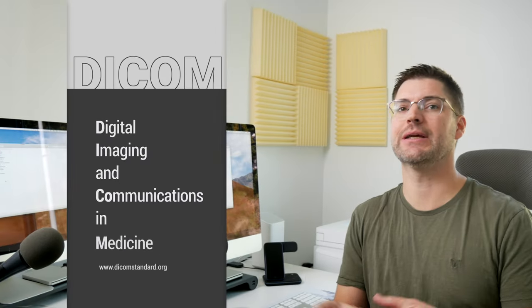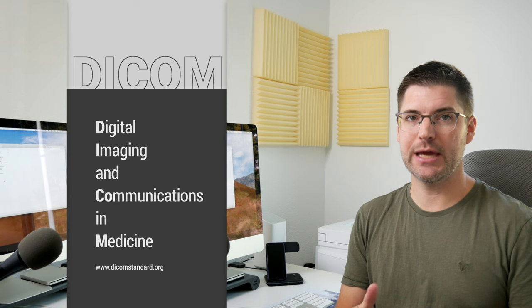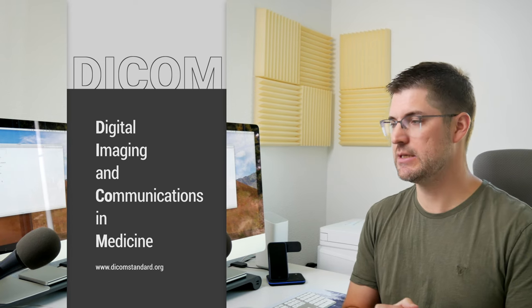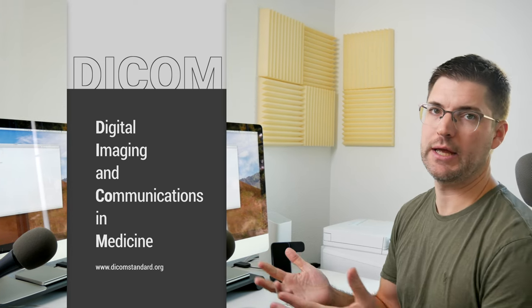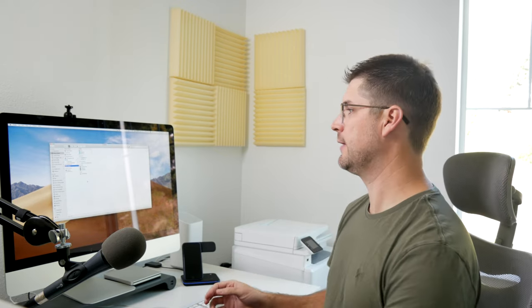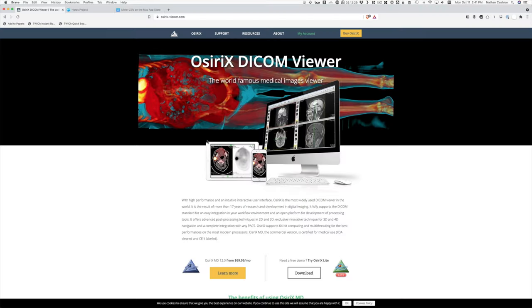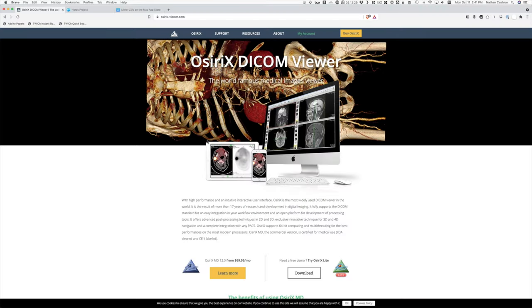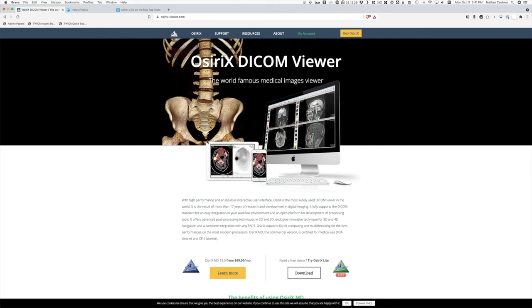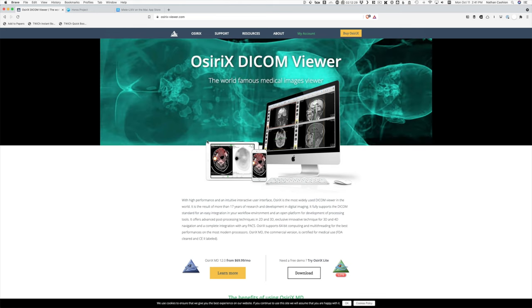Well, DICOM is digital imaging communications in medicine, and this is the standard for any type of medical imaging, whether it's plain film, x-ray, whether it's MRI, CAT scan, ultrasound. And there are a number of DICOM viewers for the Mac. The most widely known one is probably Osirix. This is a very powerful and probably the most popular DICOM viewer for Mac. It is made for medical radiologists.